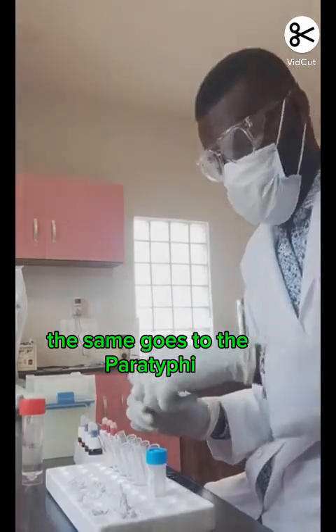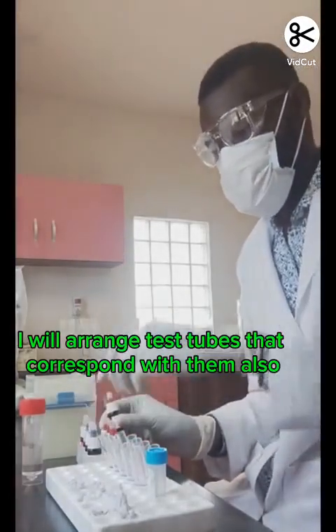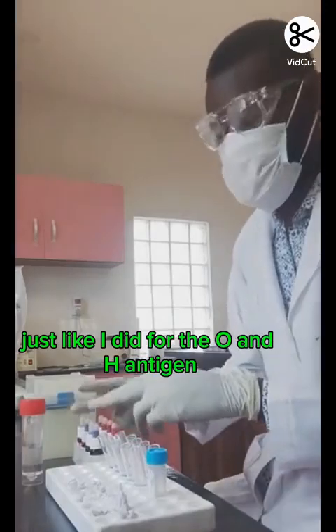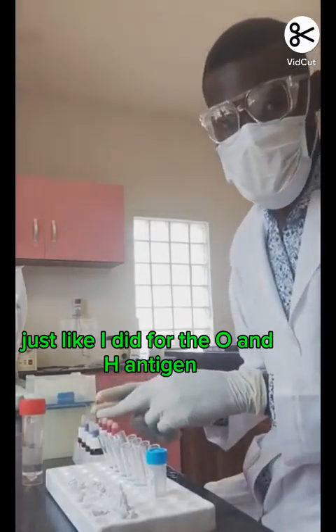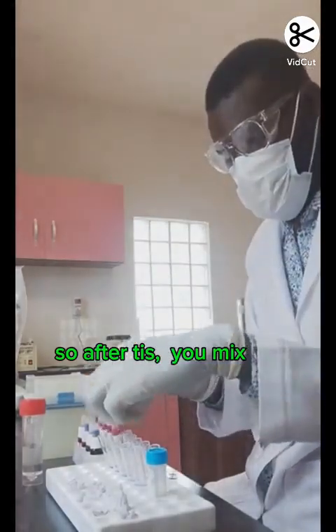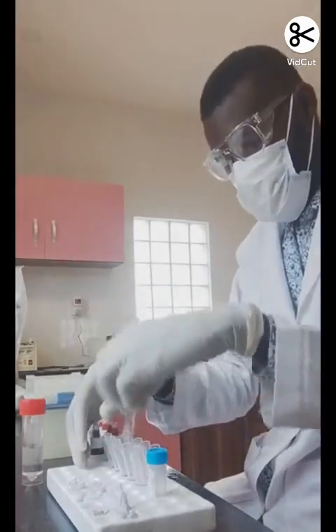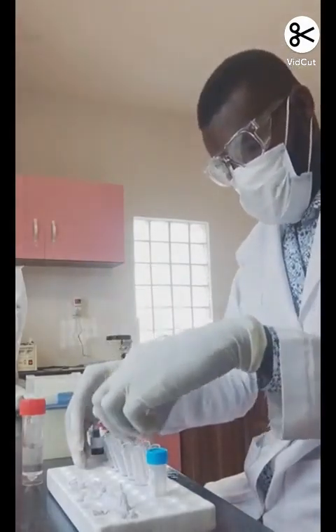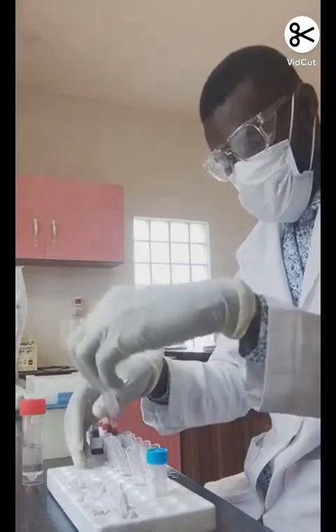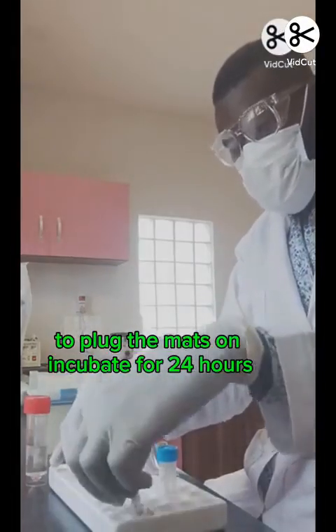The same goes for the paratyphi. So if I'm running dilution, I will arrange test tubes that correspond with them also, just like I did for the O and the H antigen. So after this, you mix, you plug the mouth and incubate for 24 hours.